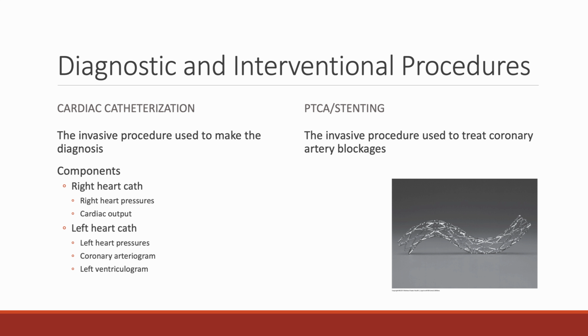The third thing we could find is one or two blockages that we could begin to treat with angioplasty or stenting. And the fourth thing we could find is the beginnings of some blockages that we're going to manage aggressively with medicines for the time being. So those are the four things that we can find. That's the diagnostic cardiac catheterization that's shown here on the left.